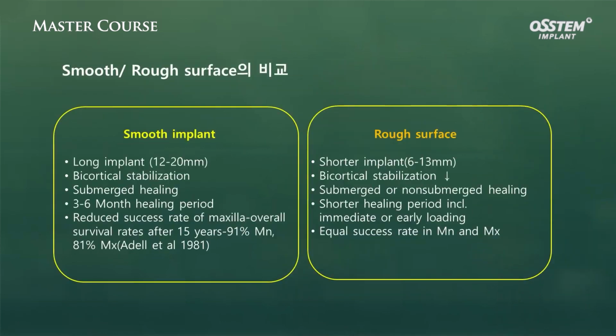About 5 years ago, there was an implant Congress in Madrid. At the time, Professor Albrektsson mentioned that now the day of rough surface has dawned upon us. He compared a rough surface along with smooth surface implants.